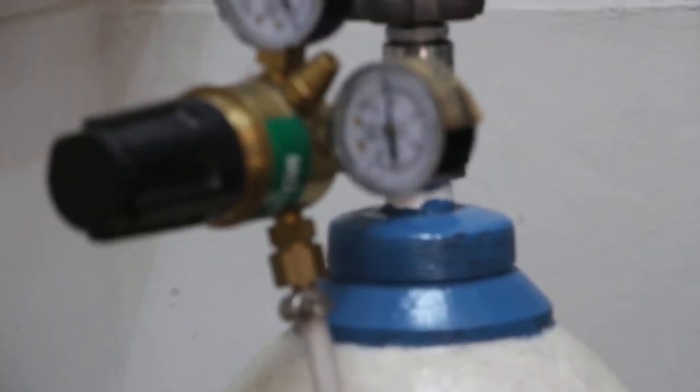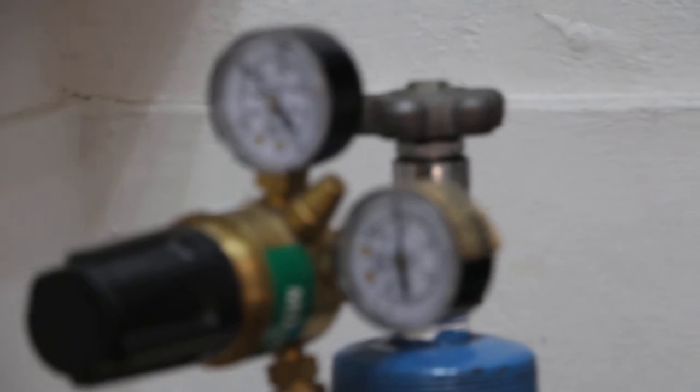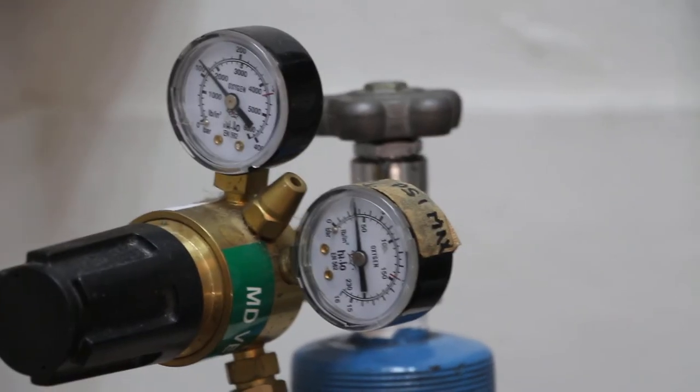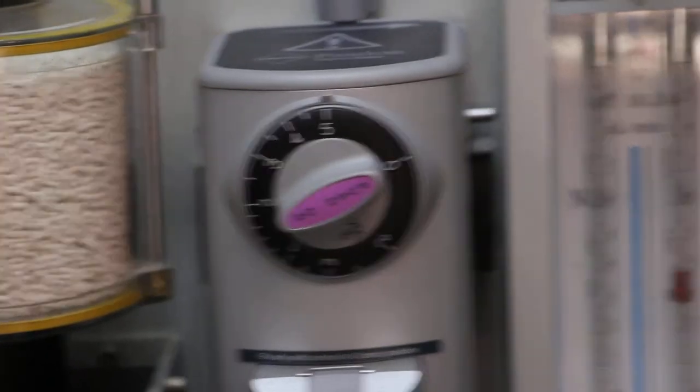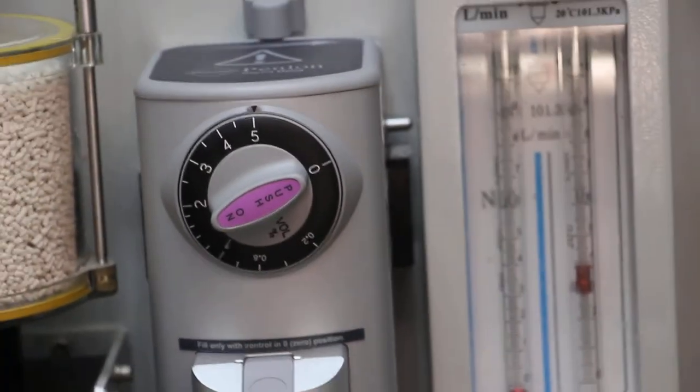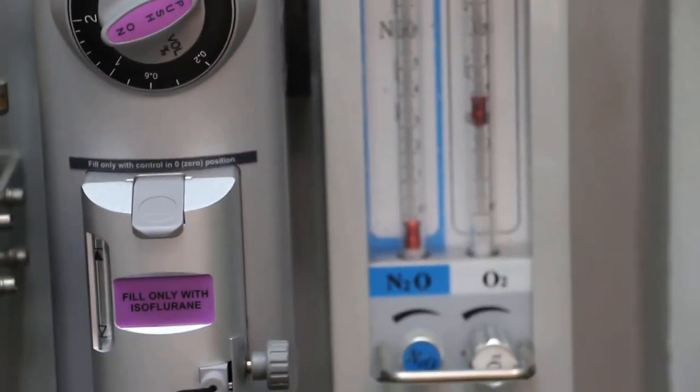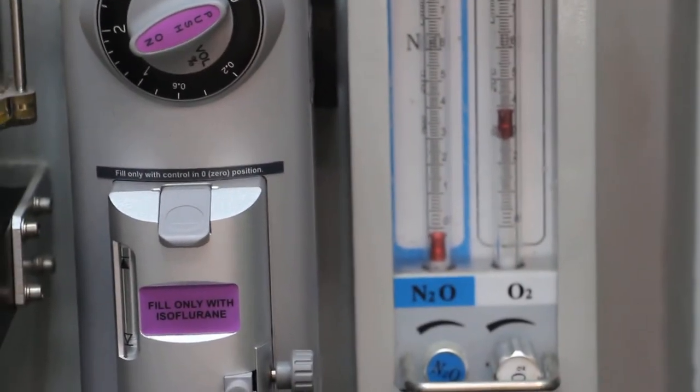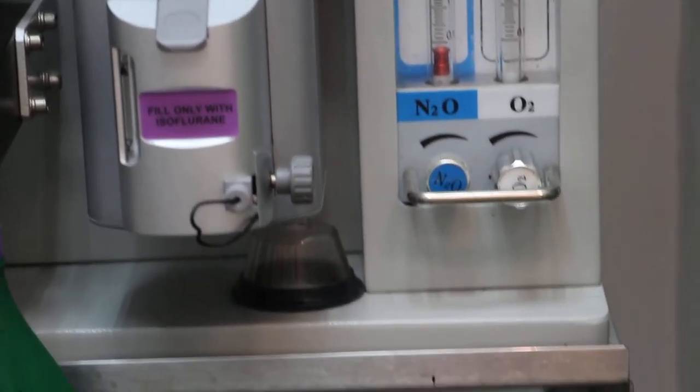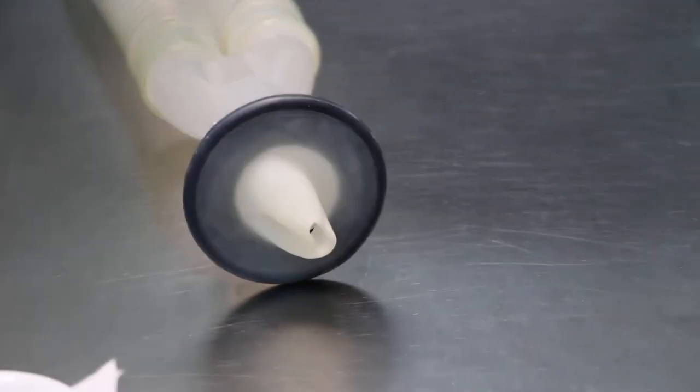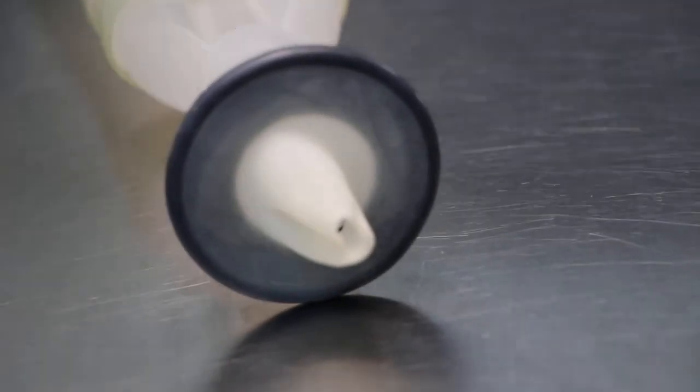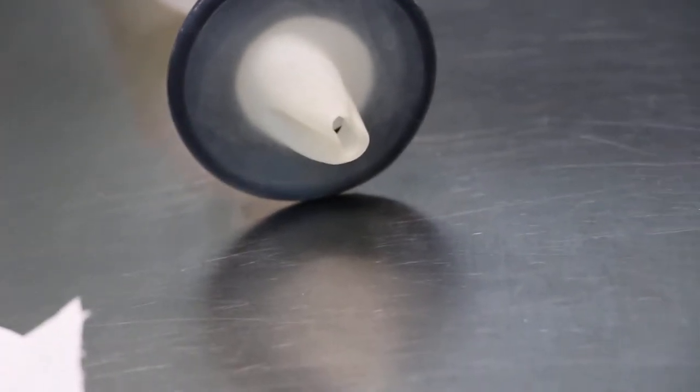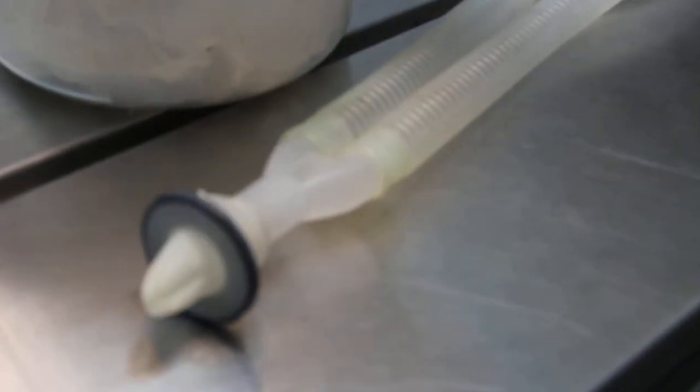The isoflurane anesthesia is on standby just in case it needs the maintenance dose, set at 5%, and it will be given for a few seconds if needed through the mask. This mask is specially prepared using a glove and cutting a small hole there for the hamster's nose. It's an improvised inhalation mask used for rabbits and small mammals.